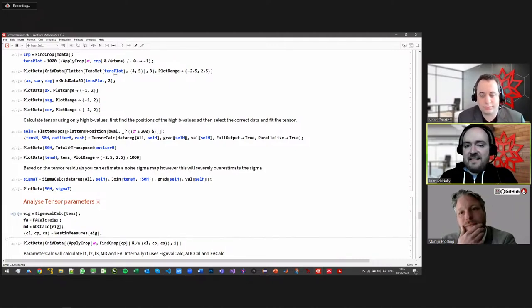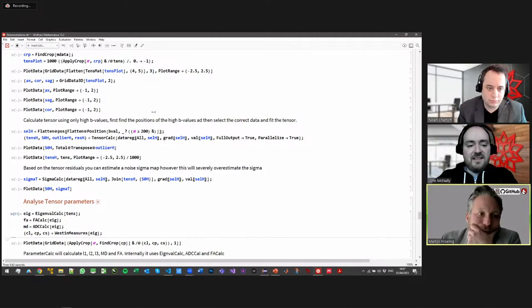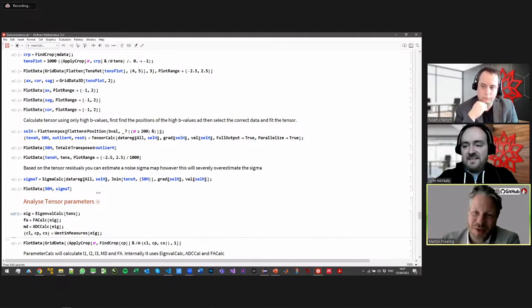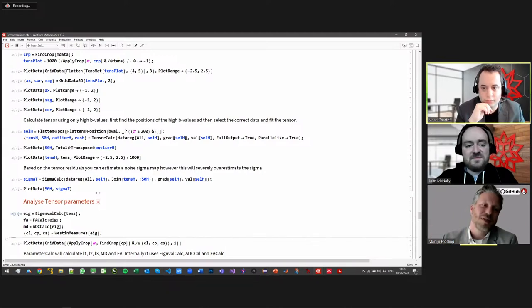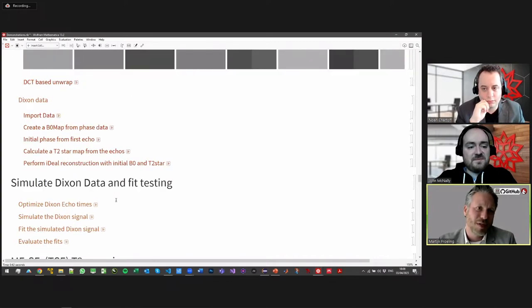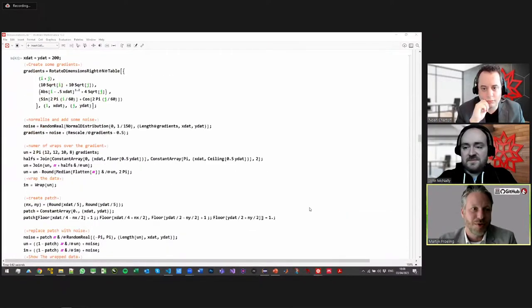I wanted to take the opportunity, given that comment, to ask: what are the sorts of things that come up a lot in QMRI, in terms of functionality within this tool set that you've built? So basically all these applications are loading data, processing data, generating pictures, and then quantitative maps. That's the main pipeline, so most of the functionality is related to one of these steps. Then of course there are basic things that I need, so there's some basic functionality that I've added to the language that is really needed for these large scale things and is actually not in the language.